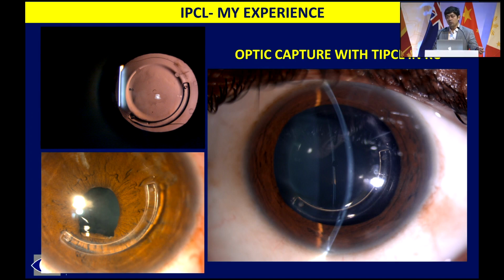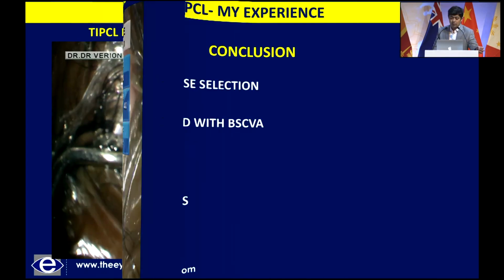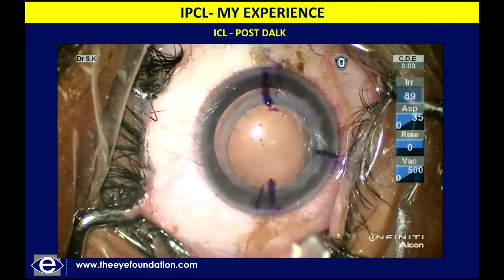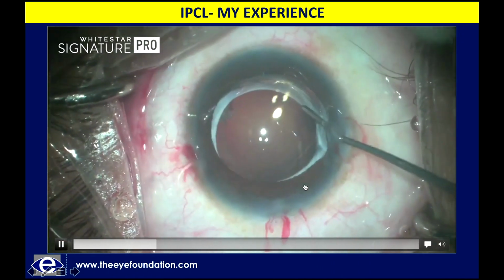So what we do whenever the Kmax of the patient is high, we just undersize the lens by 0.5 millimeter and then go ahead and implant, and this works out very well in these keratoconic patients as well. So really appropriate case selection, patients with good best spectacle corrected visual acuity and sizing gives optimal results even in keratoconic patients. It can be used post-DALK as well. For paucity of time, I'm just running through this. It can be used as a piggyback lens as well.